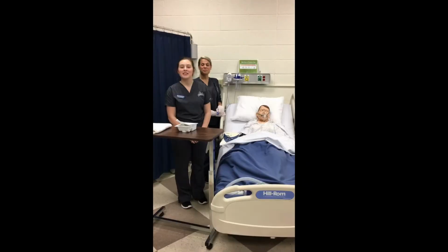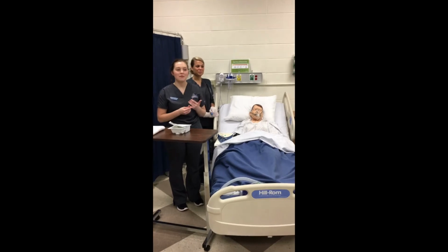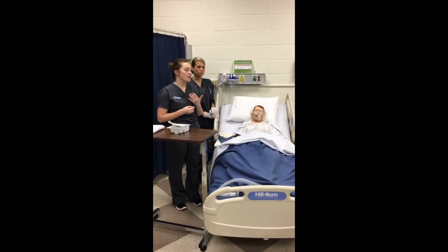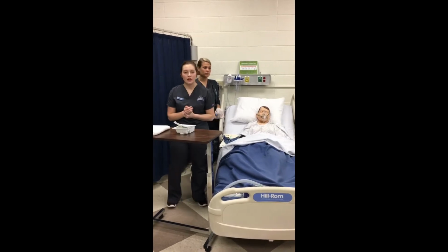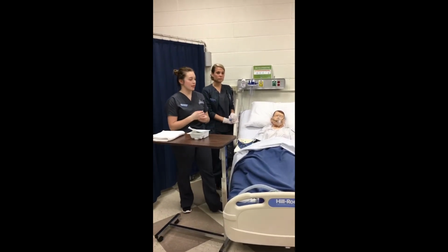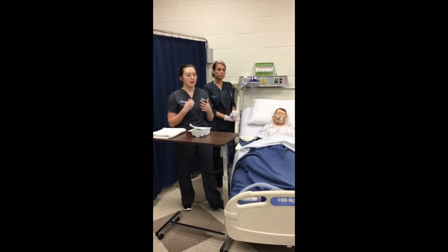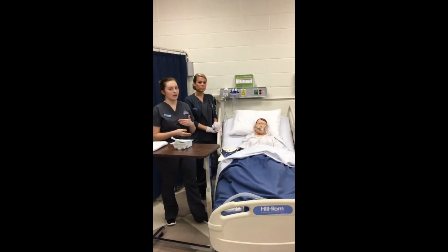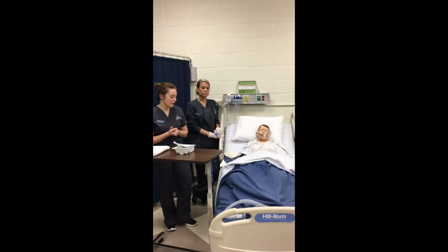Hi, it's Mackenzie, and for the third part of my video today, I'm going to be showing you how to do endotracheal suctioning. So what you're going to want to do first is assess your client for any congestion and any abnormal auscultation of their lung sounds, and that would be a good indicator that they will need this kind of suctioning.